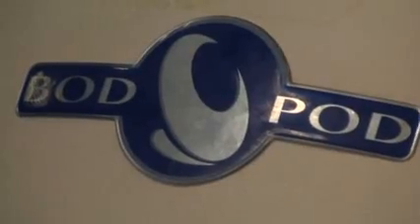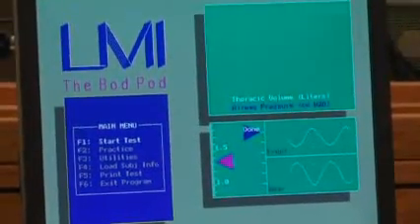The Bod Pod is a computerized egg-shaped chamber used to determine lean body mass and body fat percentage. It is one of the most accurate, safe, and fastest ways to measure body fat, and it works with almost all populations. To do this, the pod uses air displacement similar to underwater weighing.